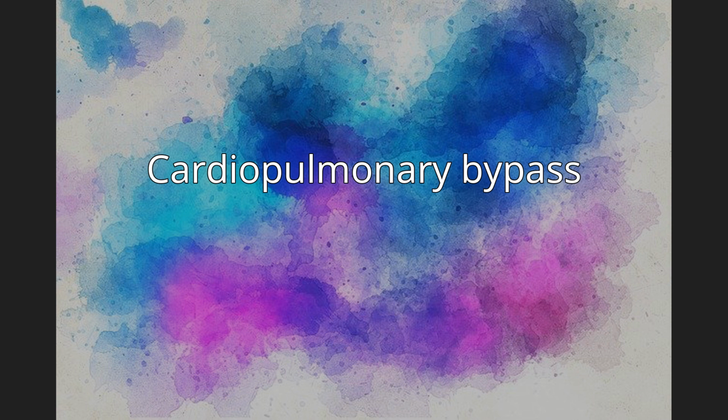from the body. Venous blood is removed from the body by the cannula and then filtered, cooled or warmed, and oxygenated before it is returned to the body by a mechanical pump. The cannula used to return oxygenated blood is usually inserted in the ascending aorta, but it may be inserted in the femoral artery, axillary artery, or brachiocephalic artery, among others. The patient is administered heparin to prevent clotting, and protamine sulfate is given after to reverse effects of heparin.